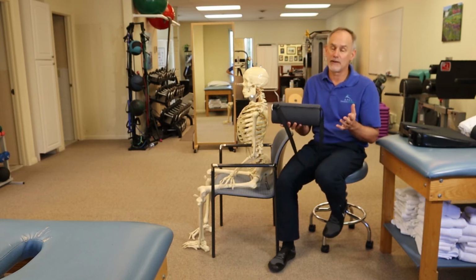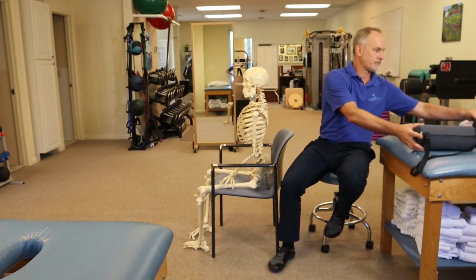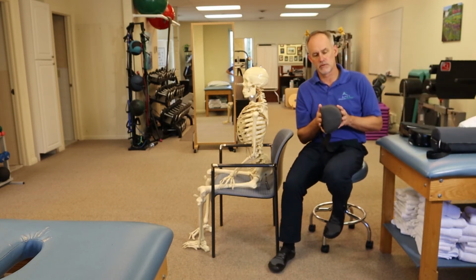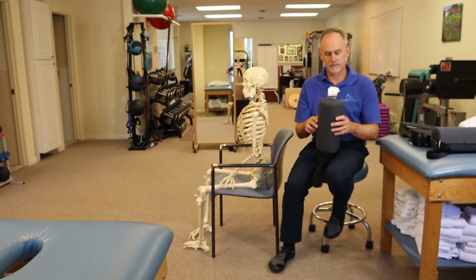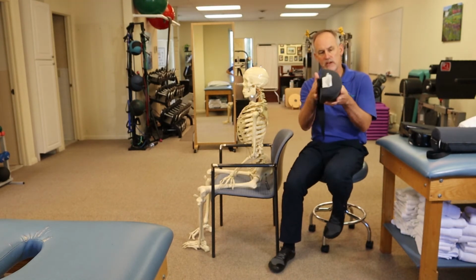There are different types of rolls actually that you can use. You can use these half rolls. This particular one is a little bit denser. Great little roll. It just depends on the person. It tends not to shift as much because it's flat on one side.